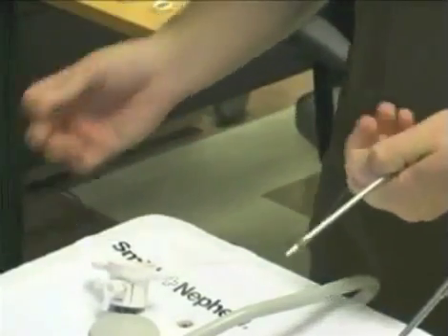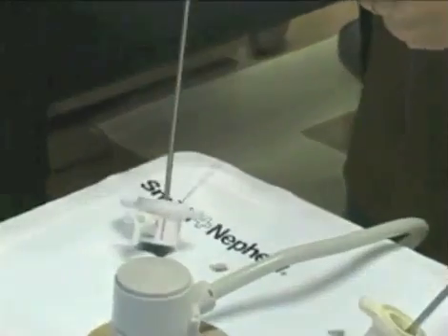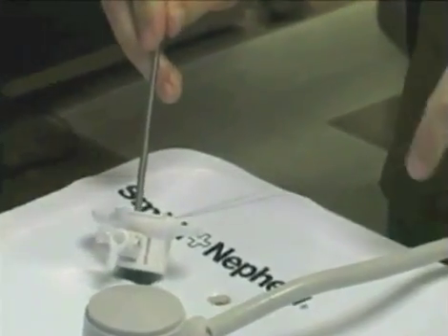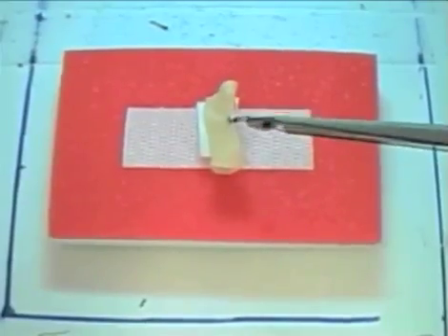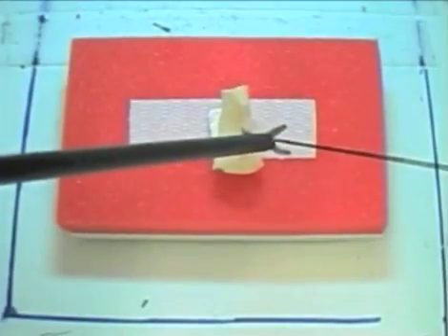If you are not familiar with a one-handed knot, a two-handed knot can be done with a re-threading of the pusher with each throw. Again, the task is completed by cutting the stitch.